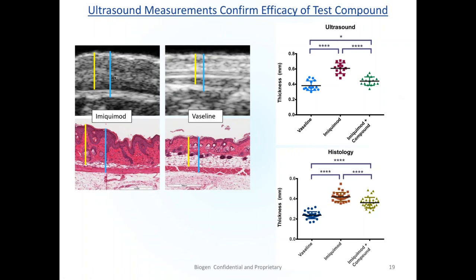You want to give them a complete explanation of what this signal means. If we're using the signal as the endpoint of our studies, as the readout of the therapeutic intervention with the compound, it's very useful to have at least a theory, based on the histology comparison, to explain what we're actually looking at.